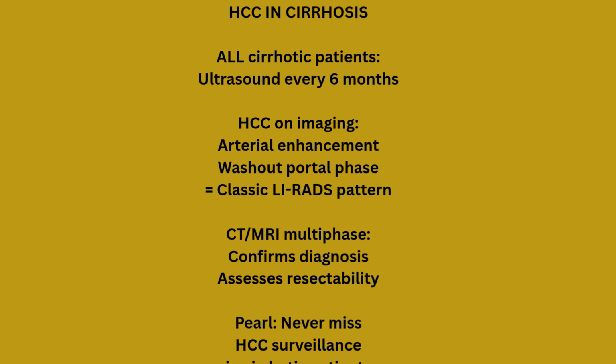All cirrhotic patients need ultrasound every 6 months for HCC surveillance. Arterial enhancement with washout on portal phase is a classic LI-RADS pattern. For details, see Short 28.